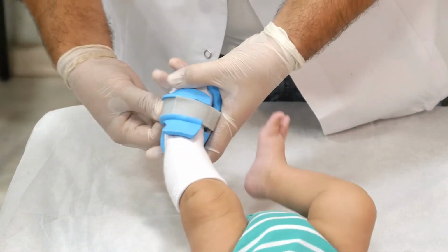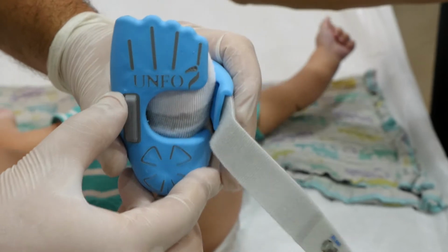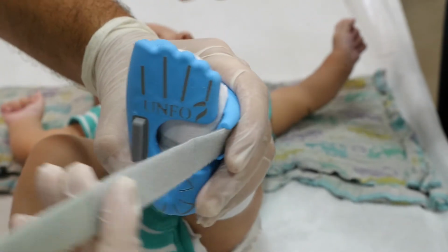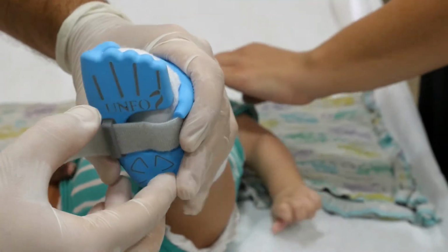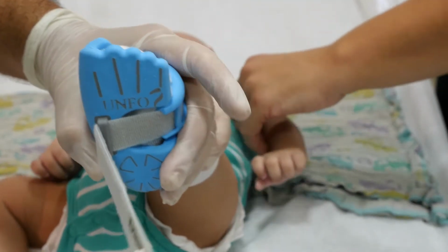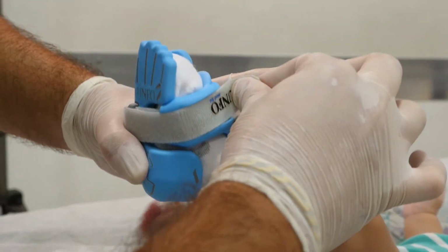Embrace the foot and the cushion together tightly and avoid any void between the foot and the cushion. Thread the strap and stretch it over the foot and the brace's body. Don't over-tighten the strap forcibly.